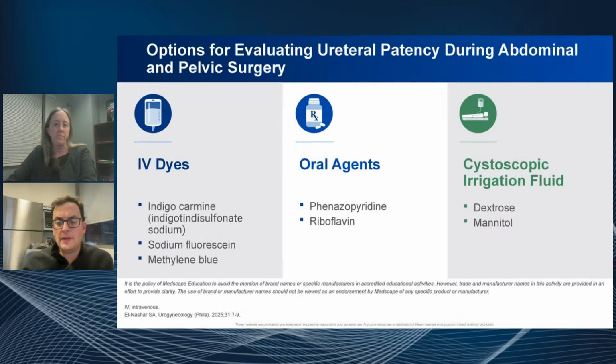Yeah. So, I think there are, first of all, people that'll do a cystoscopy and look at a ureter and say, oh, it's peristalsing. I have personally kinked ureters with stitches for prolapse where it peristalses, but it's obstructed. There are stitches that can do that. And then there are times when I think I see efflux, but you don't want to get into that mindset of like, oh, it can't happen to me, or it didn't happen to me. And in my mind, having some agent or some way of increasing the probability of me being sure that efflux is actually efflux is a good thing.